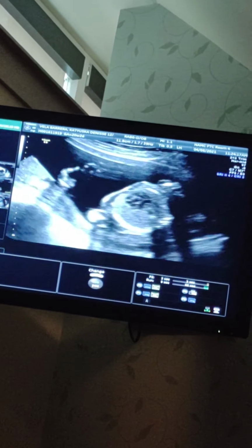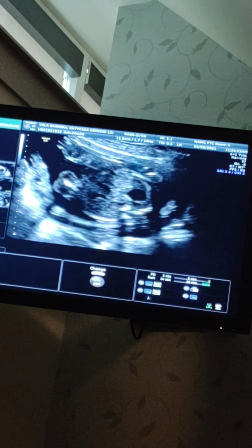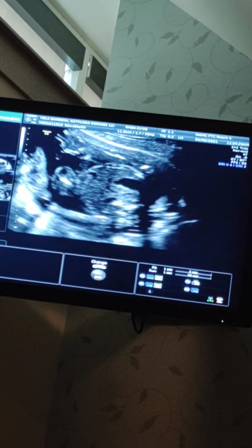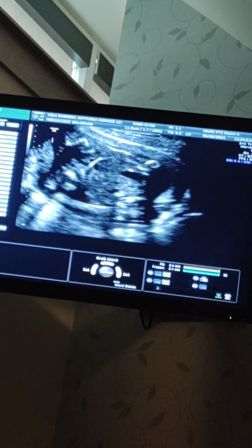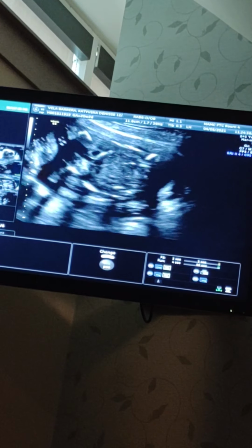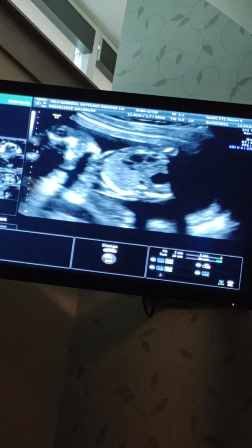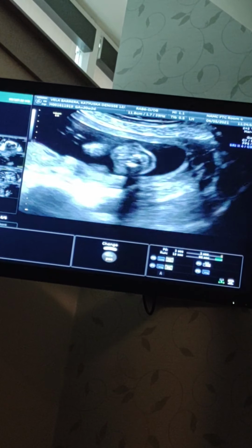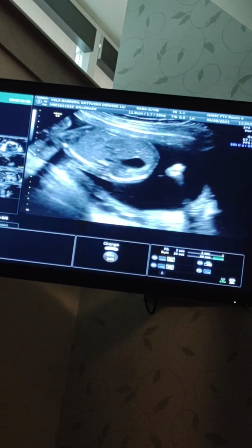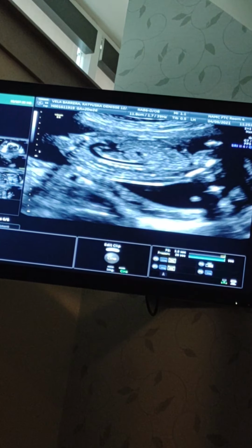The baby's kind of laying down on it. It's fine, but I'm trying to get the baby to roll over. There's one of the kidneys there. Saw the bladder earlier. We have the face and the brain. We really just need the spine and a couple more heart views. Let's see what we can do about that, baby. Come on. This is the aortic arch right there. See, it looks like a candy cane.